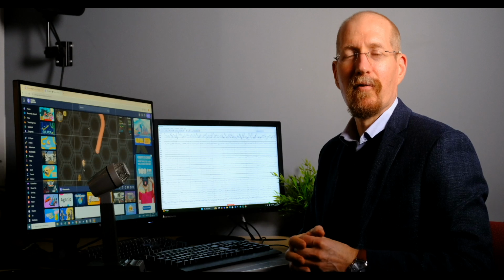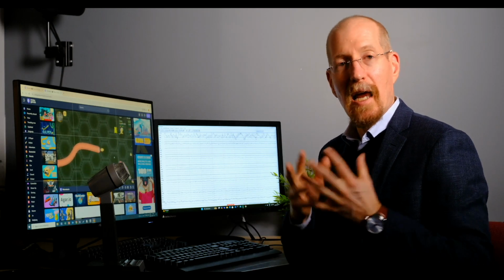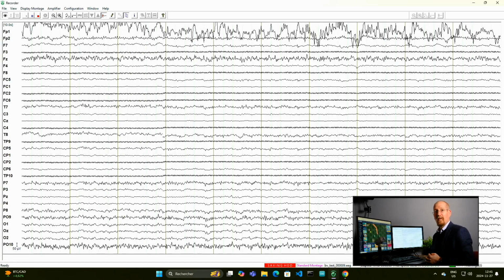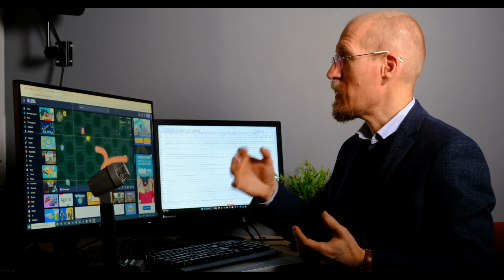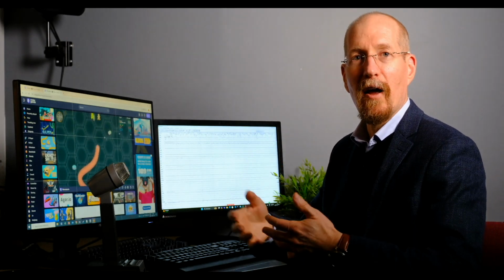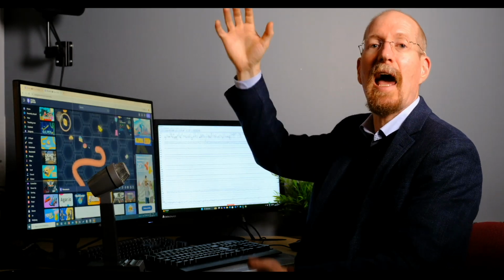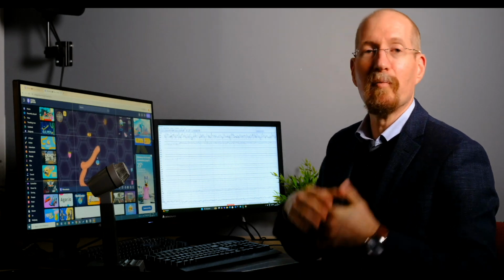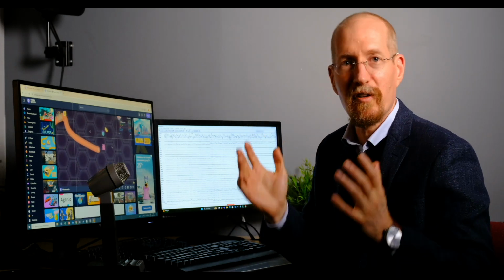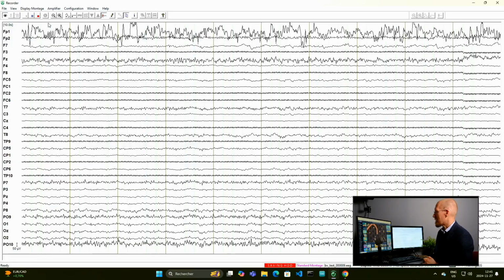Typically, we need at least a few minutes of noise-free EEG activity for our analysis. It can vary from study to study. Some studies will have multiple trials, and that could be the case. For example, we could have a number of trials of a very simple task. We could repeat this task multiple times and then average those trials together at the end. For the sake of simplicity in this training, we're just going to do a single trial with a couple-minute window, and then we'll move on to the next task.